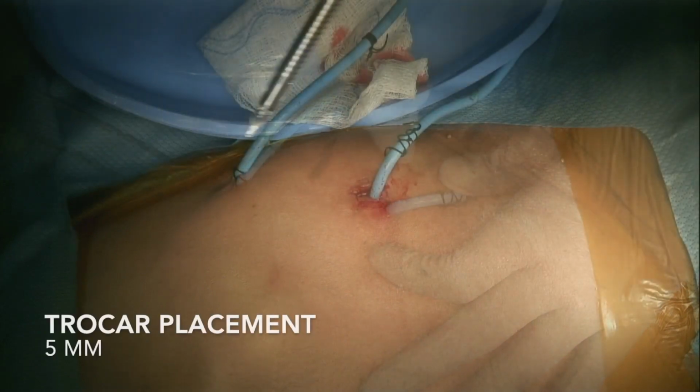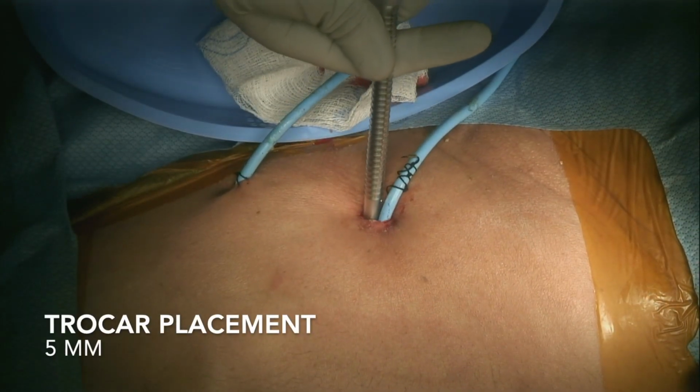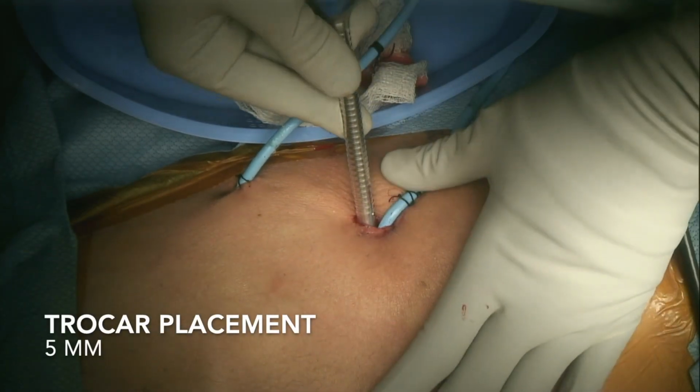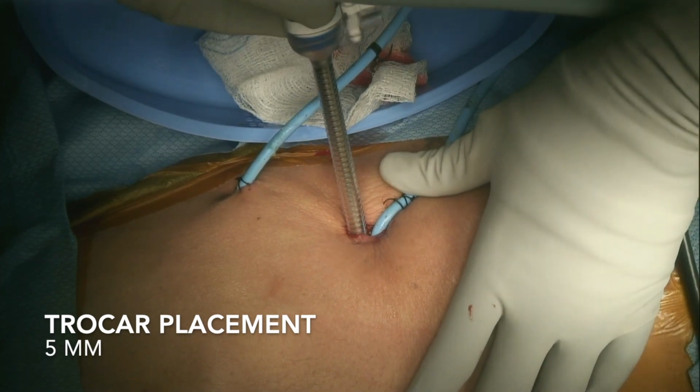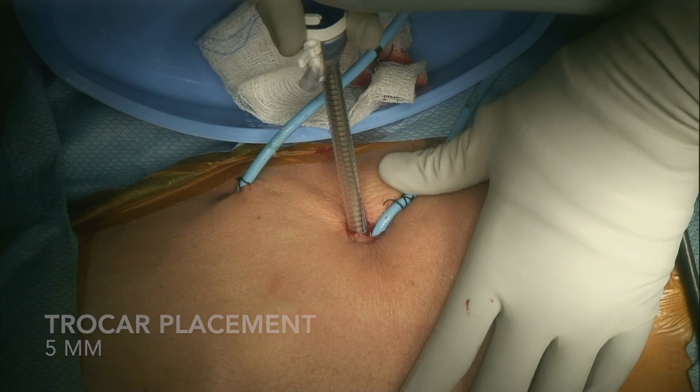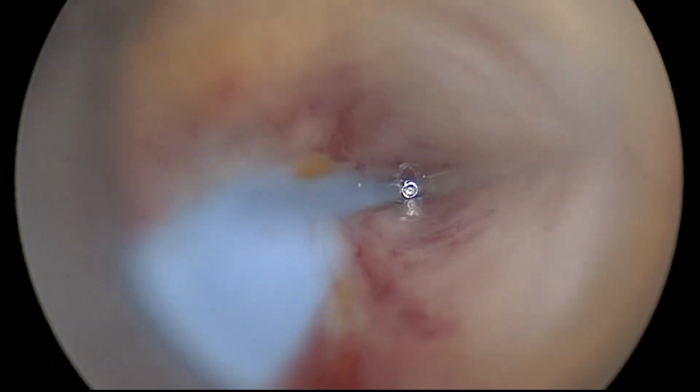At this point, we decided to do a video-assisted retroperitoneal drainage. We inserted a 5 mm OptiView trocar using the lower drain as our guide. This allowed us to enter the retroperitoneal abscess cavity.